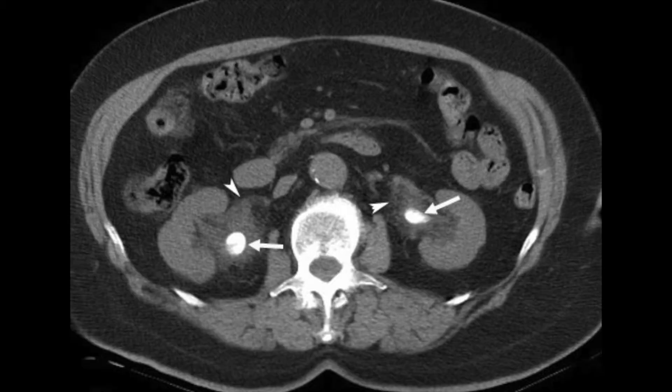Here's another scan which is a cross-sectional CT scan, and you can see two large stones in each kidney with inflammation around what we call the renal pelvis, so these stones would definitely need treating.